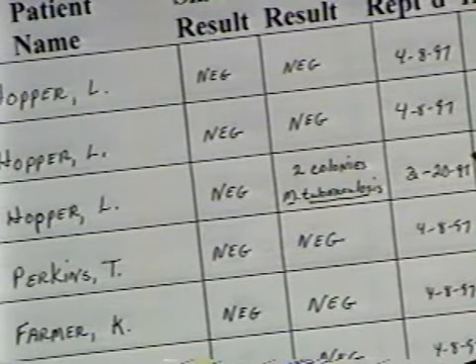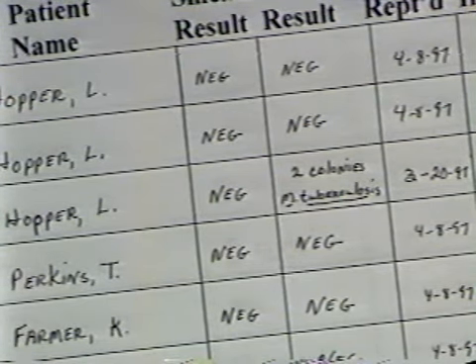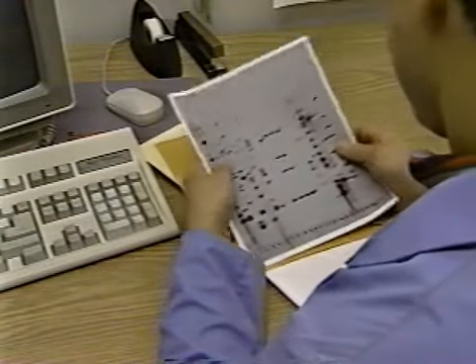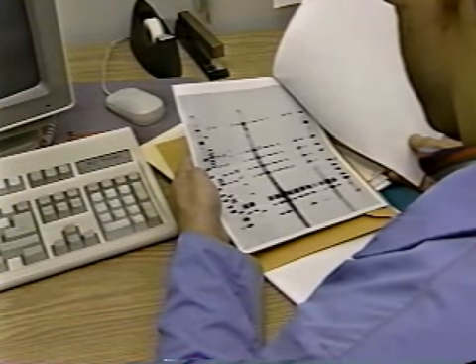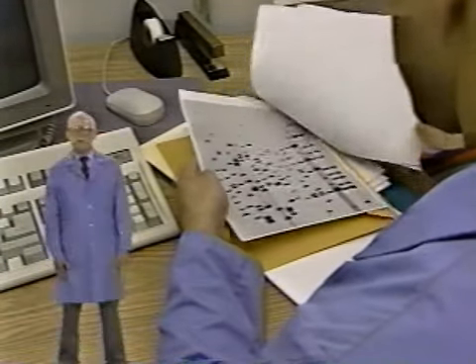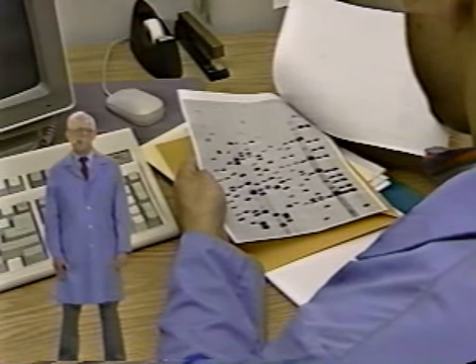Establishment, maintenance, and frequent reference to laboratory data may help the laboratorian to pinpoint and quickly focus on the possible source of a problem. In your booklet, you will find suggested record-keeping tools for data organization. Specific biochemical and drug susceptibility test patterns and restriction fragment length polymorphism, or RFLP testing, also known as DNA fingerprinting, can be valuable in confirming that cross-contamination has occurred. Contact your state health department laboratory for assistance in referring samples to an RFLP reference laboratory.